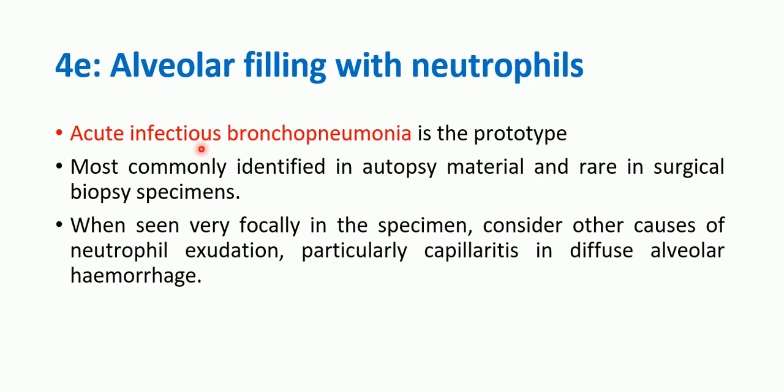4E is when neutrophils are filling the alveolar lumen, and acute infectious bronchopneumonia is the prototype, commonly seen in autopsy material. And when it is seen very focally, the differential diagnosis includes capillaritis and diffuse alveolar hemorrhage. We're done with pattern 4.